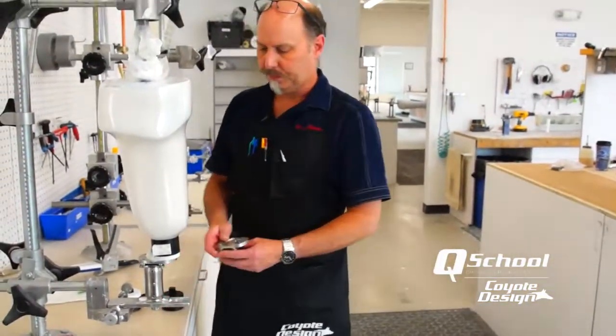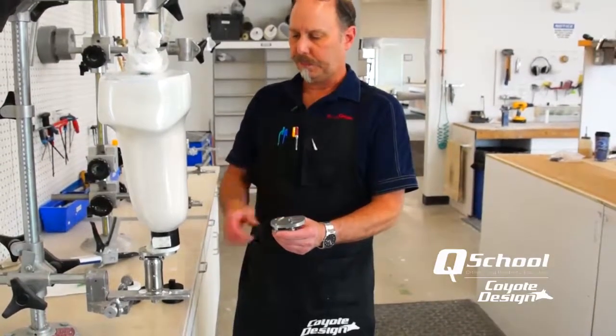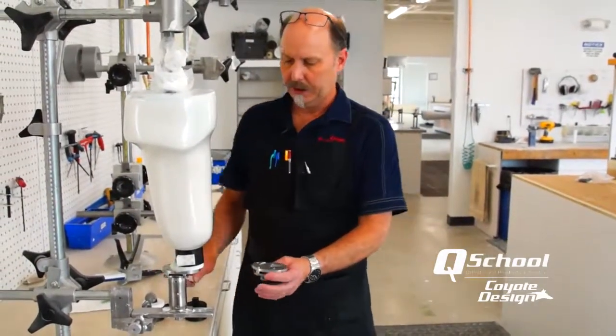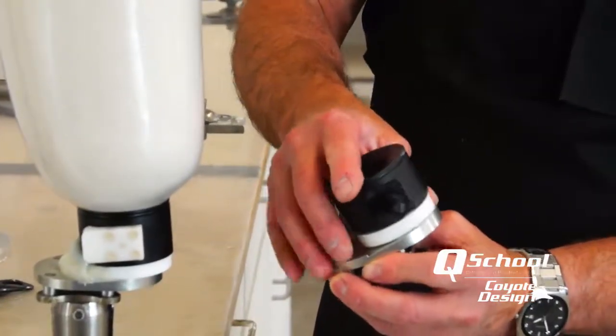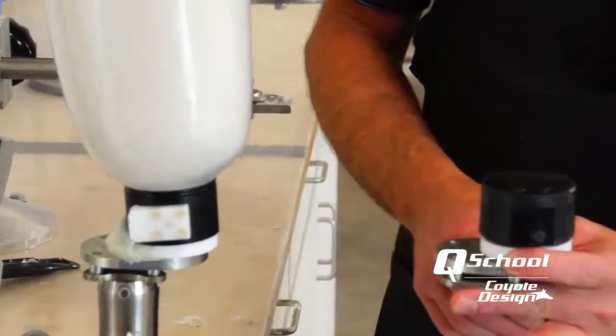So what we've got is our five-degree offset lanyard plate. I've got it set up here in the jig with a deep lock already glued on. What I've done is mounted this in my jig, taken my lock, got it ready to laminate, set it down on the jig, and then tagged it back here to temporarily hold it.